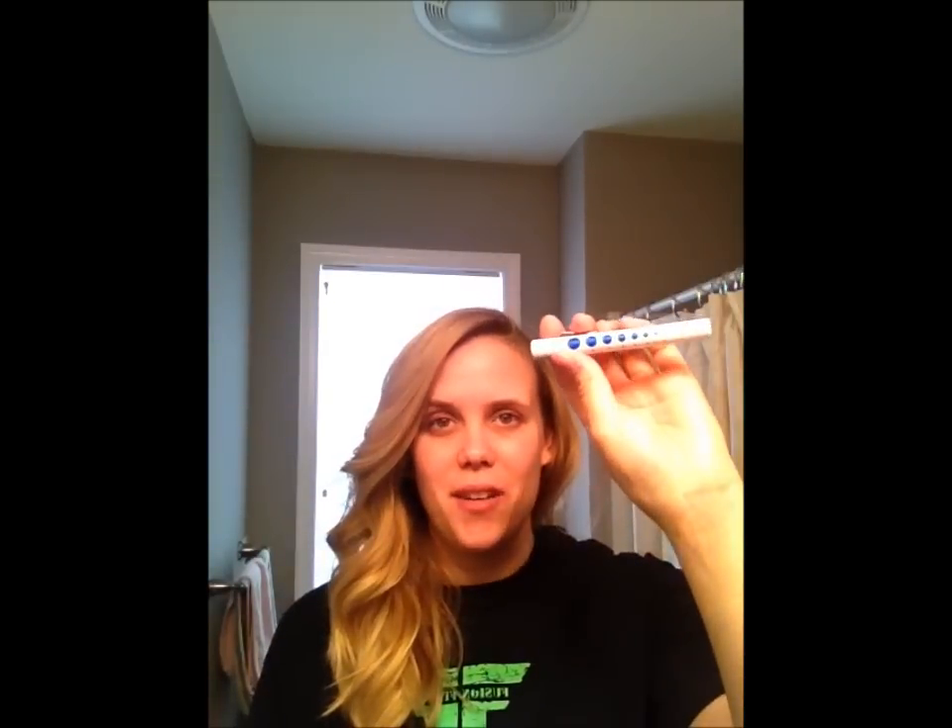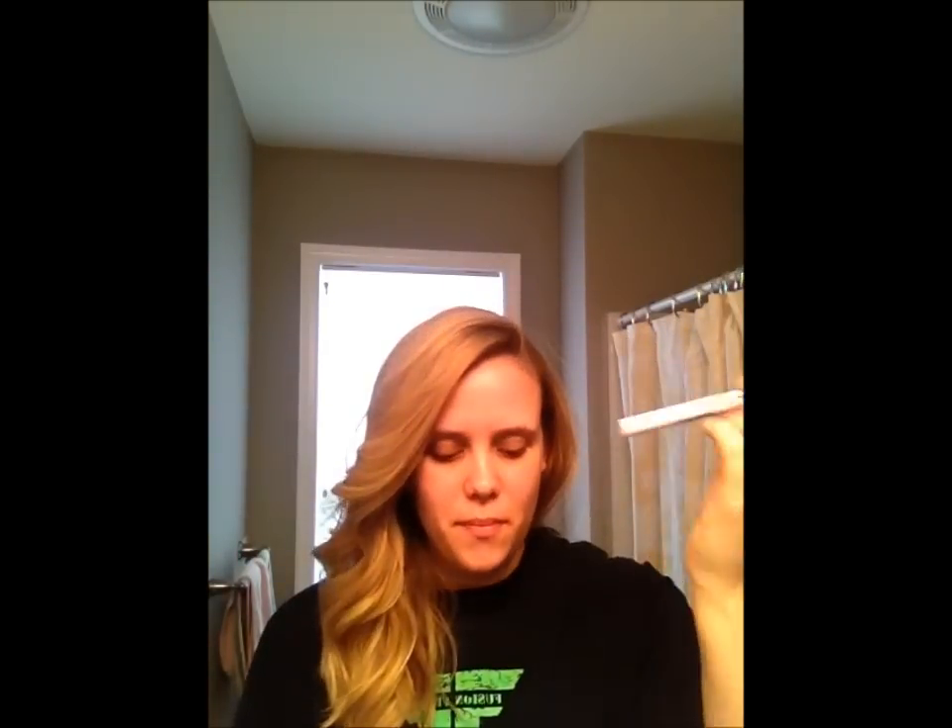The next thing I bought was this pen light. They didn't say that we needed this on our supplies list right away, but I think I'm going to eventually need it. So I bought one — it's just a very basic pen light with the pupil gauge on the side. The pen light was $5.